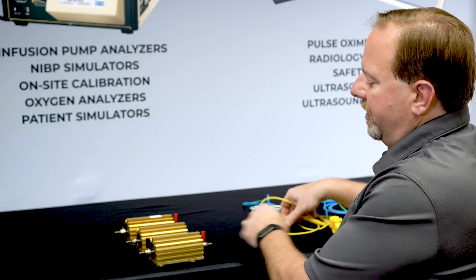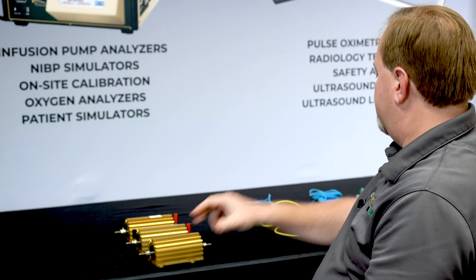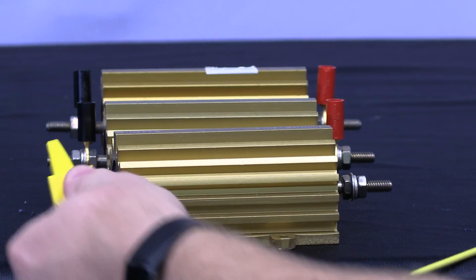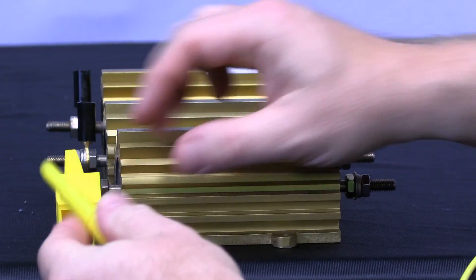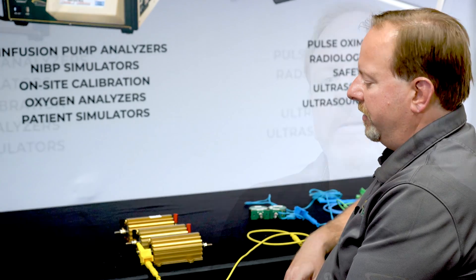If you don't have the banana jacks like this one, we can still connect to that load using the alligator clips that come in the accessory kit. All we do is put the alligator clip on the load and plug the banana cable that comes with the accessory kit into that alligator clip.